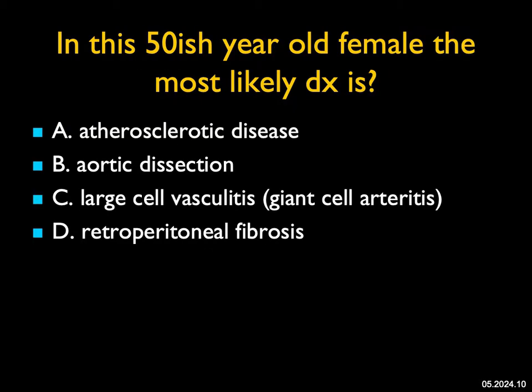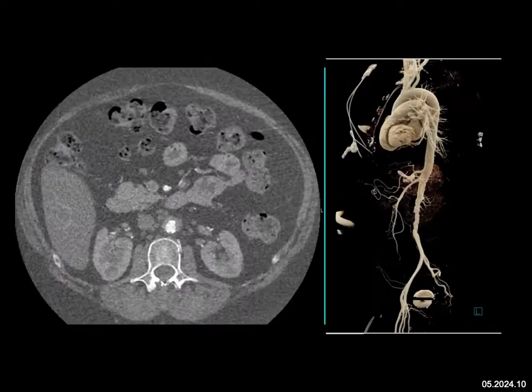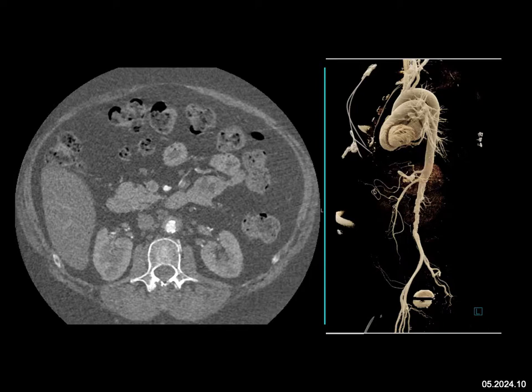In this 50-ish-year-old female: on axial views, the aorta at the level of the kidneys is narrowed in diameter with soft tissue thickening. On cinematic rendering, it's not just a focal area — it's really the entire aorta beginning just beneath the SMA down to the iliac vessels. It doesn't have the look of simply atherosclerotic disease, and it's not a dissection. Retroperitoneal fibrosis is a consideration for narrowing of the aorta, and there's a little bit here to make you think of it.